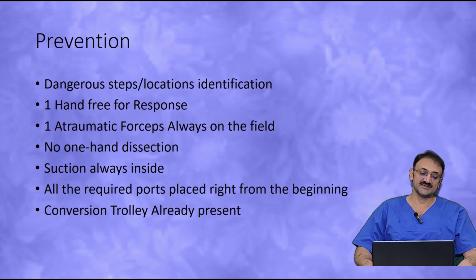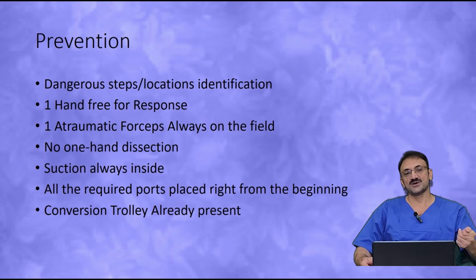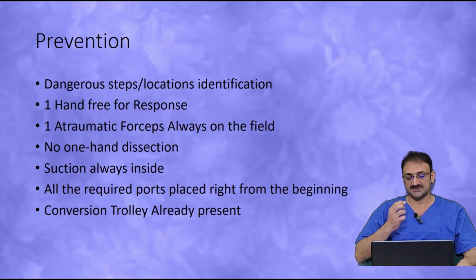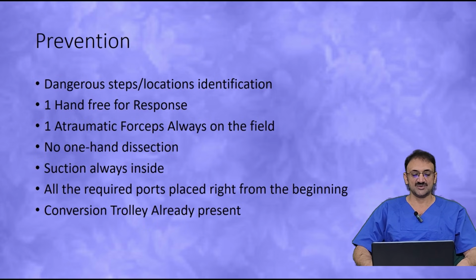No one-handed dissection is recommended. Dissection must always be two-handed, because laparoscopy is all about ergonomics and hand-eye coordination. So if one person is retracting for you and you are doing dissection with one hand, that is not really going to work, because you don't know how much he is retracting. Is he retracting more than is required? Because such retraction may lead to avulsion of the veins and small tributaries of the veins. So two-handed dissection must be performed.